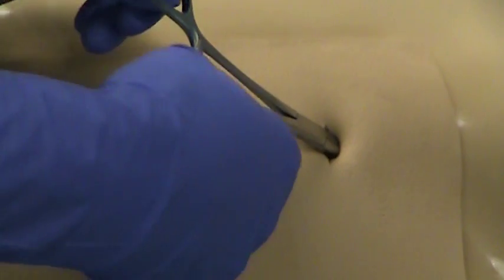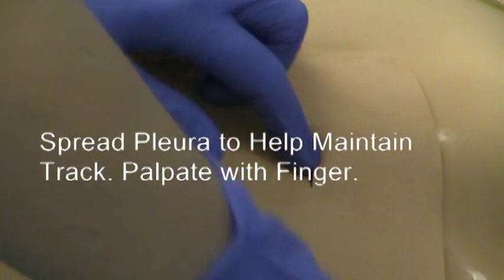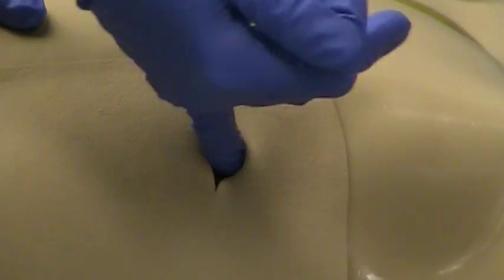When you get through, you want to go ahead and spread your clamps as wide as they possibly will go, and this does take some force because there's quite a bit of resistance. And then you want to try to pull them back as open as possible to maintain that. If you haven't made a good track, you can lose your track if you're not very careful. The other thing you want to do is go ahead and get usually a pinky finger in to make sure that there's not lung adhesions to the chest wall or something like that that might be in your way.